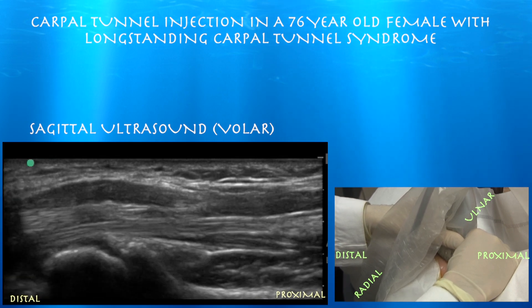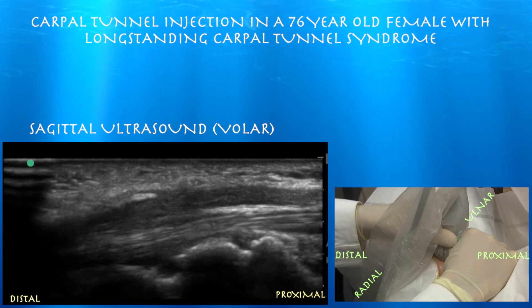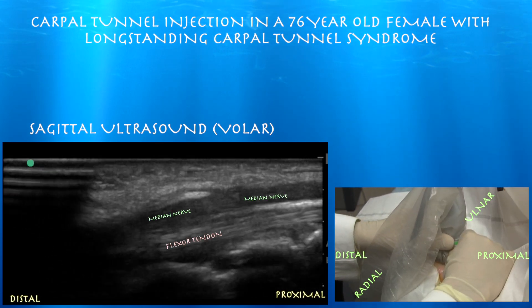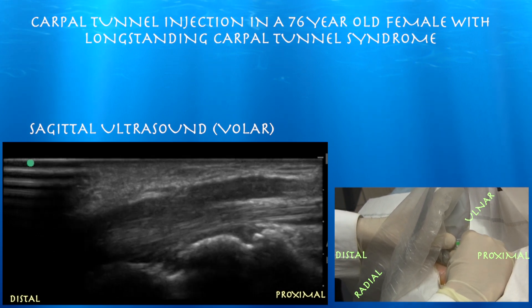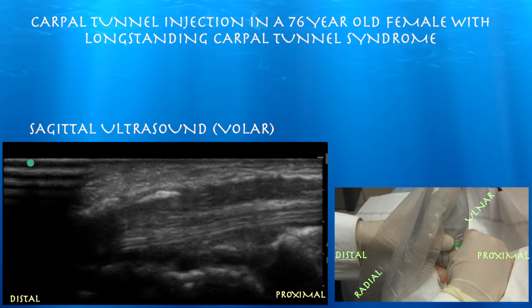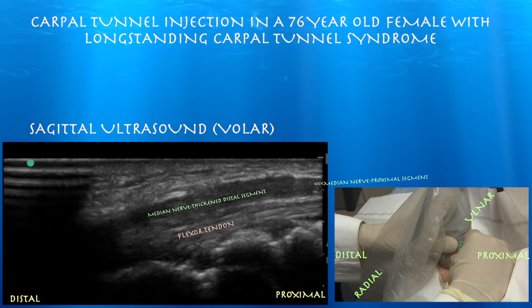Sometimes you can see a notch sign. The right side of the screen is proximal. It does look thickened overall — you can see a thickened median nerve, and it looks like it's a little bit thinner proximally, consistent with carpal tunnel syndrome. It is a pretty subtle finding.